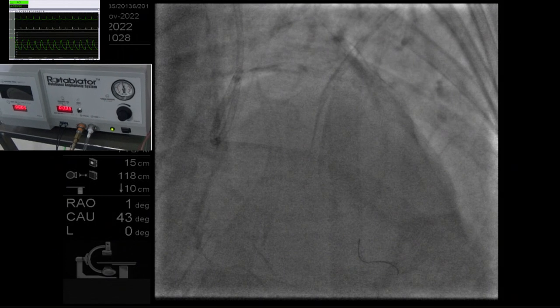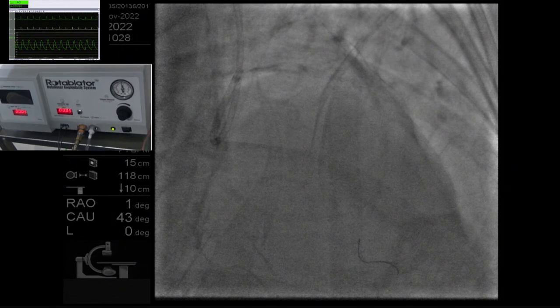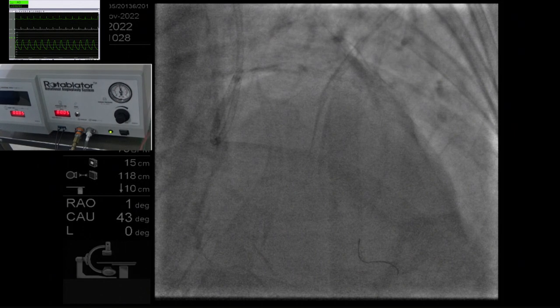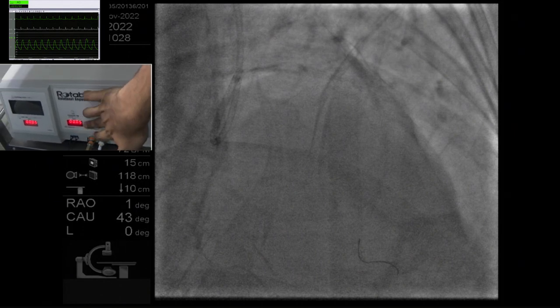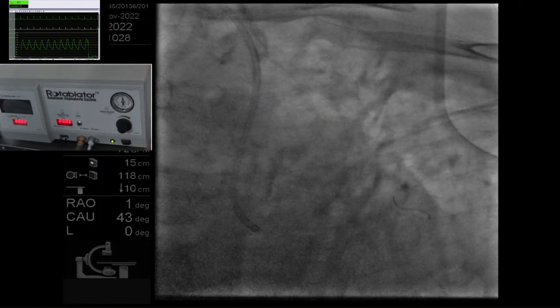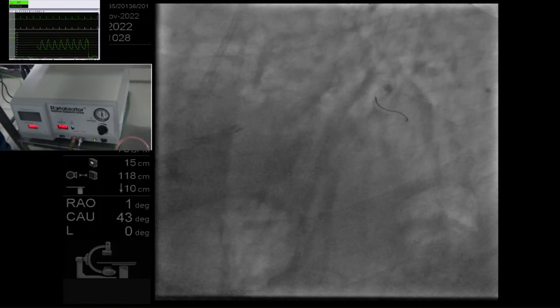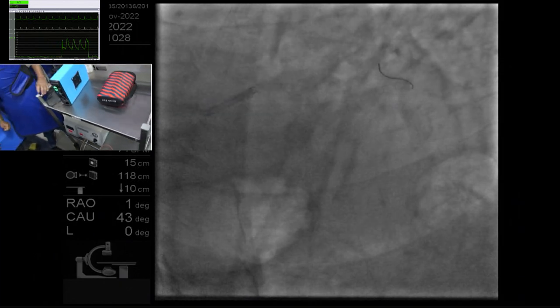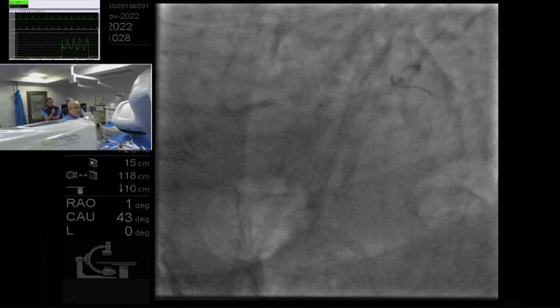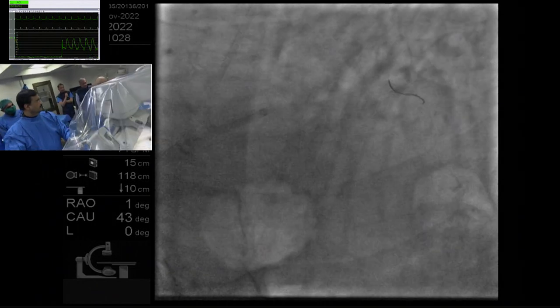Again, one of the things you're doing when you're testing is platforming and the speed, but you're also looking to make sure that you're getting an increase in the flush. That should increase, and then once you get to the tip of the guide catheter, you're going to platform to get your speed. Yeah, that's very important. You test the burr outside of the patient.